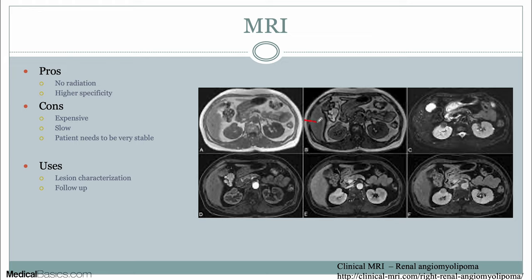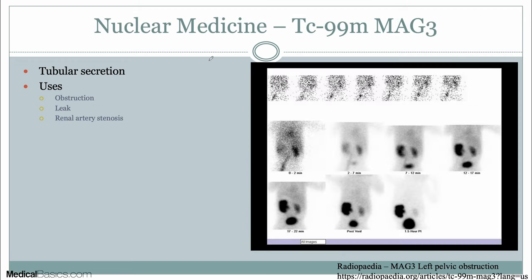In this example, we have an AML. We have the Indian ink artifact of this right upper pole lesion, showing that there's macroscopic fat that you wouldn't necessarily be able to say with as much confidence on other imaging modalities — although you would be able to at least infer it and then get an MRI to confirm.